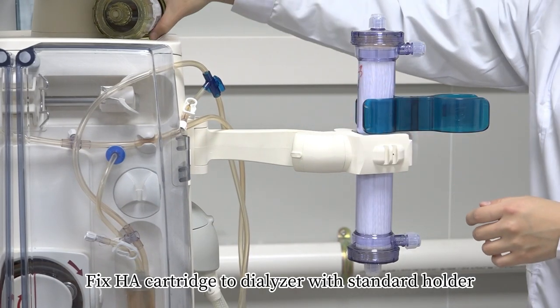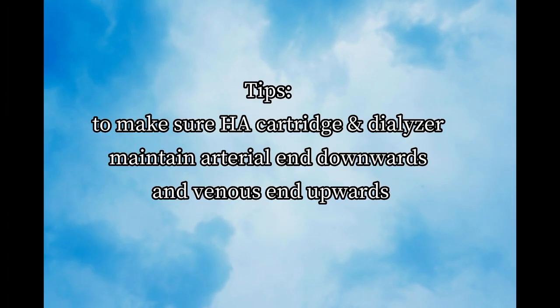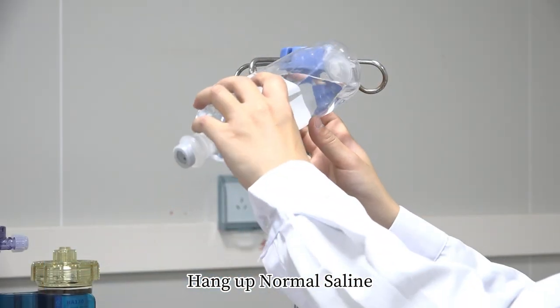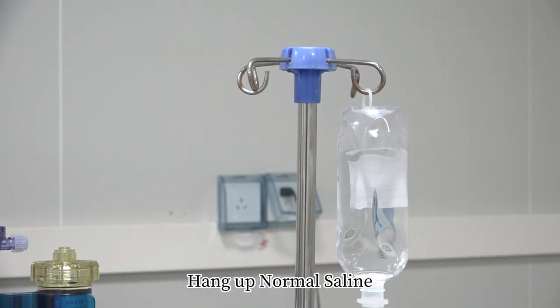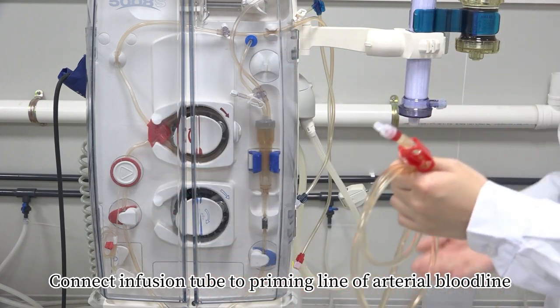Fix HA cartridge to dialyzer with standard holder. Tip: Make sure HA cartridge and dialyzer maintain arterial end downwards and venous end upwards. Hang up normal saline. Connect infusion tube to priming line of arterial bloodline.